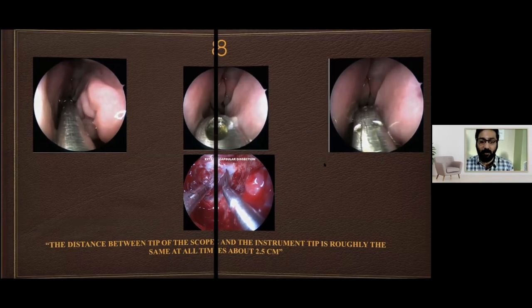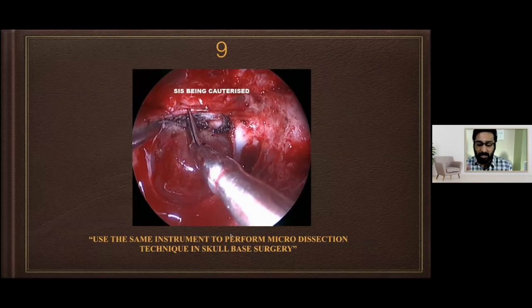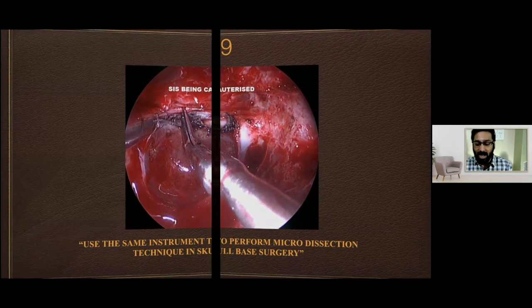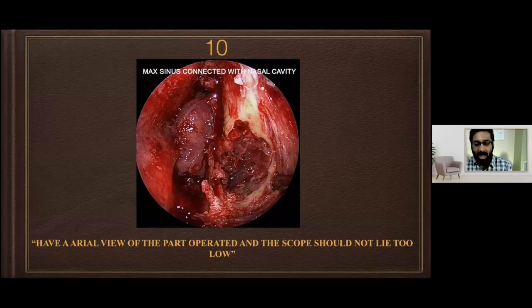So this is a craniopharyngioma. I'm just operating. Use the same instrument. Don't try to change instruments. I have a set of instruments which I use for a particular step. And always try to have an aerial view. This is called the aerial view of the surgery. Try to have an aerial view.